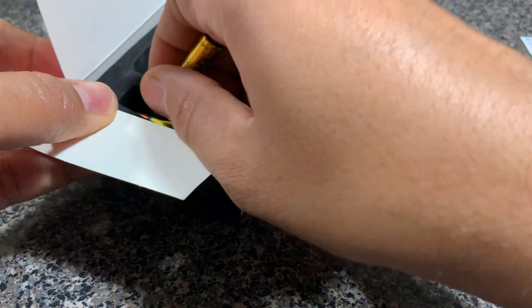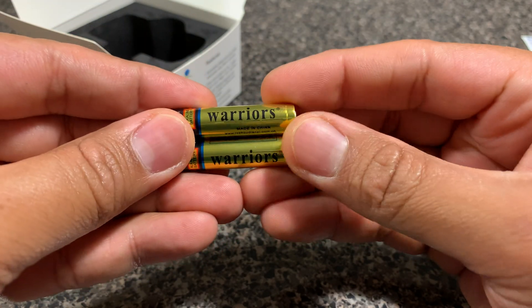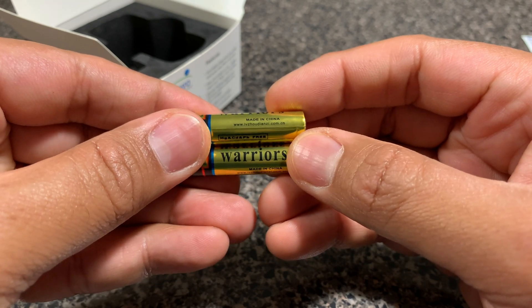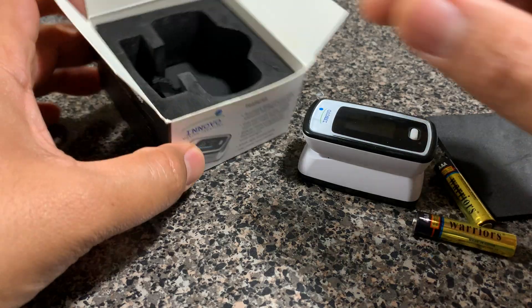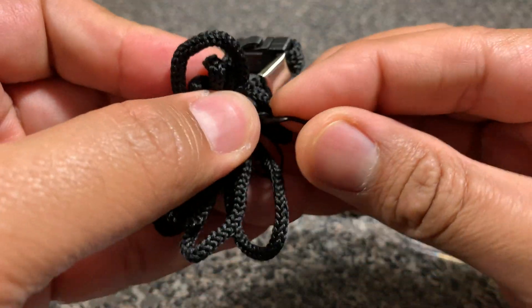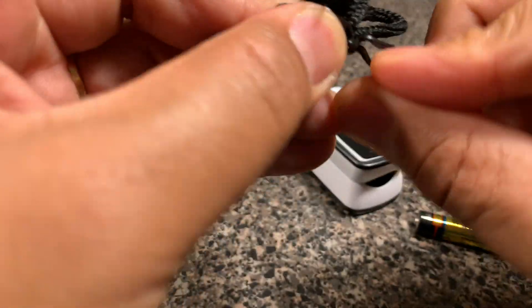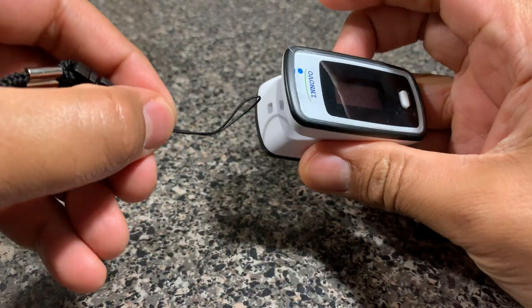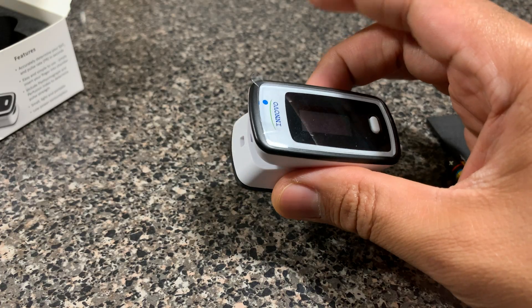I did unpack it from the battery sleeve for the purposes of this video, and I noticed that the batteries included are Warriors brand — I've never heard of this brand before. I wish they had given better batteries, but this is what comes with the unit. Along with it, they also give you this little string that you can attach to the unit itself, which is good because the device is fairly small. You just slide it in and loop it inside to keep it safe.